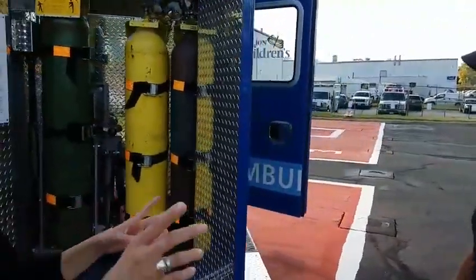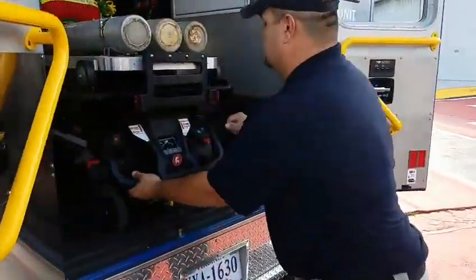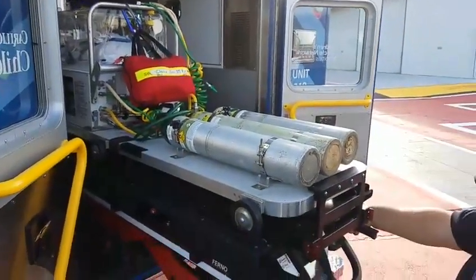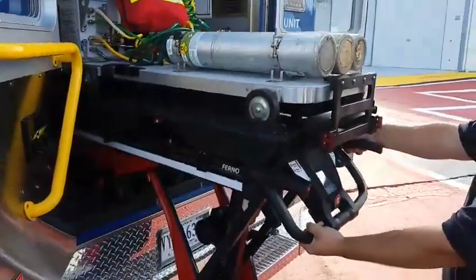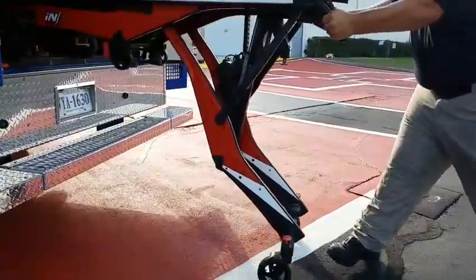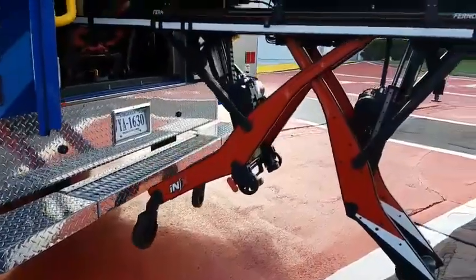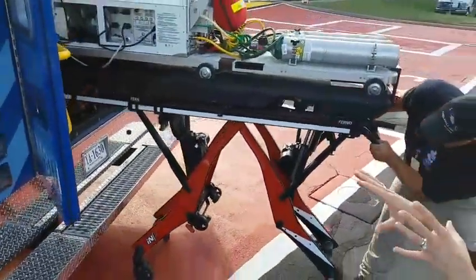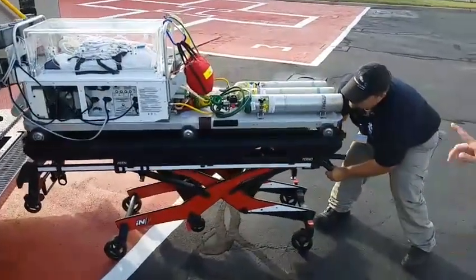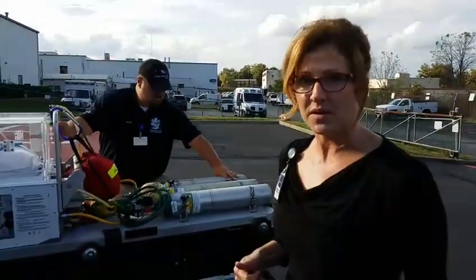And then let's give another demonstration about our stretcher technology. And I want to point out, for those of you watching and joining us, you might think that our pediatric patients don't weigh that much. Well, Jesse and the team were explaining to me that we may have a very teeny baby on board, but their isolette weighs 300 pounds. The stretcher itself weighs 200 pounds. So you're looking at 500 pounds for getting the patient stable and into the truck the way they need to be. And so this makes their job so much easier. Also, as Jesse was mentioning, it allows the patient to stay completely level, which is particularly important with our neonatal patients.